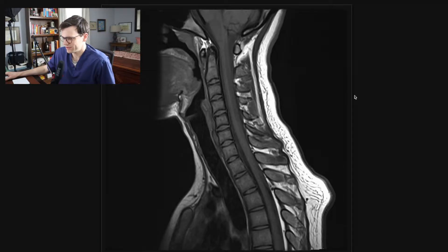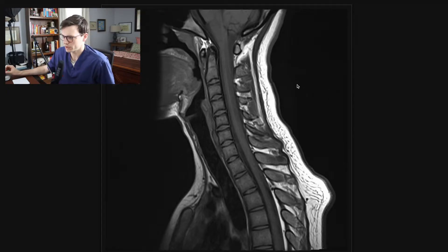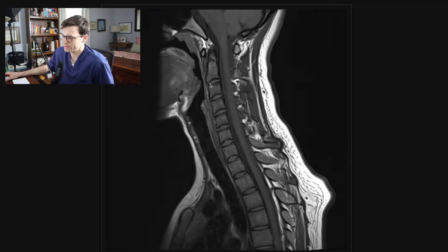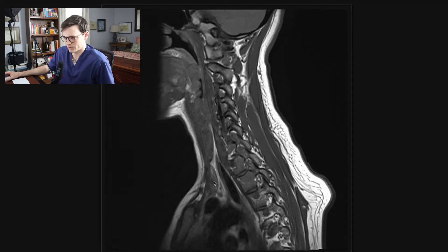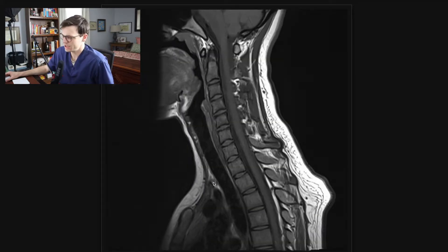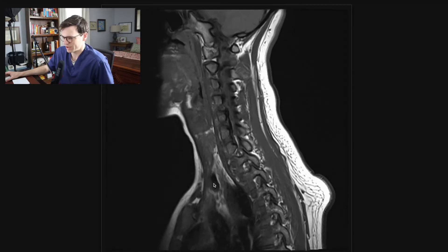What I have here pulled up on my screen is the sagittal T1. This is one of the sequences that you should always get when looking at an MRI of the cervical spine. The T1 sequence is really good for looking at the bones — that's usually where I start. I start first with the skull base and make my way down, all the way to what I can see of the thoracic spine, and I look at every single vertebra, making sure I don't see any lesion, any definite fracture, or any other significant abnormality.